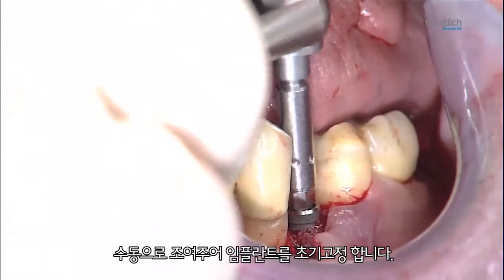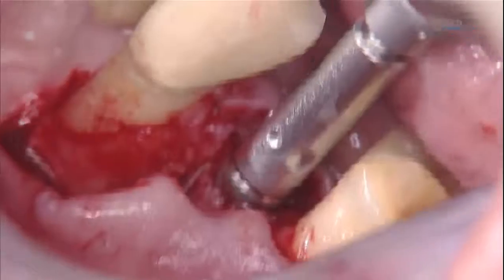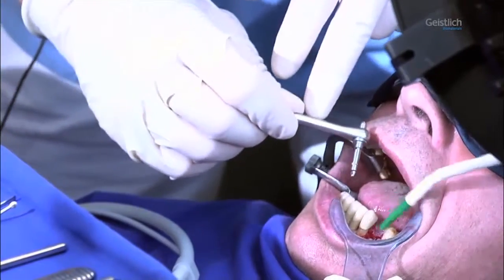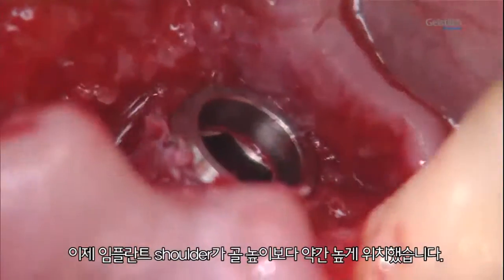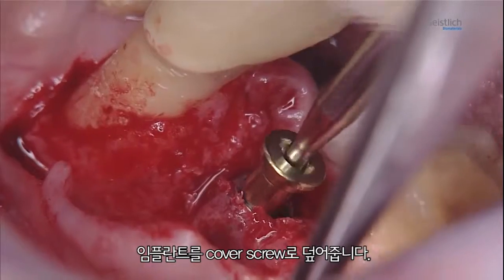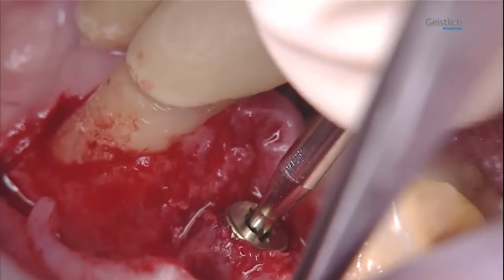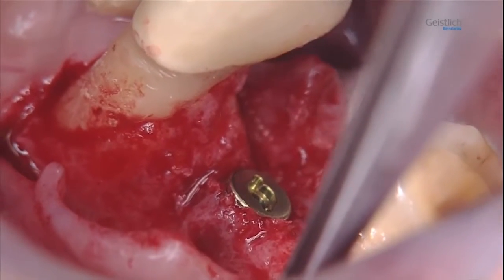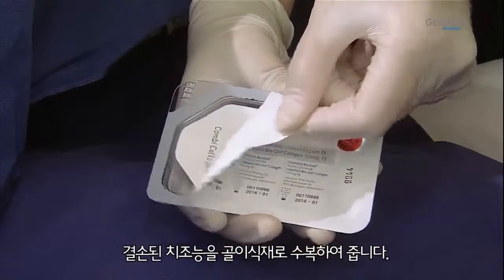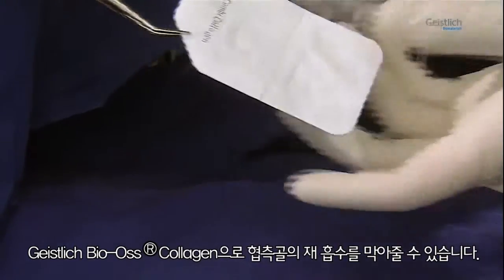Final primary stability of the implant is achieved manually using a ratchet. The implant shoulder is now located just above the bone level. The implant is sealed with a cover screw. The ridge defect is built up with bone substitute material. The Geistlich Bio-Oss collagen protects the site from resorption on the buccal side.